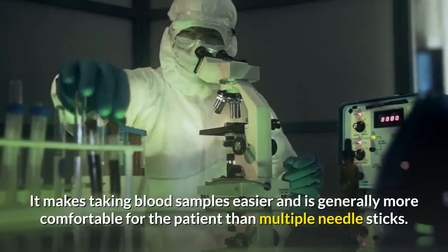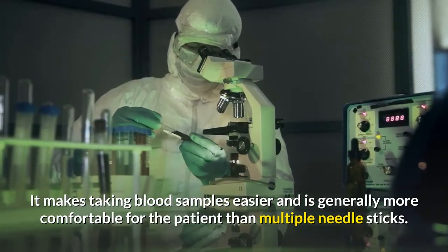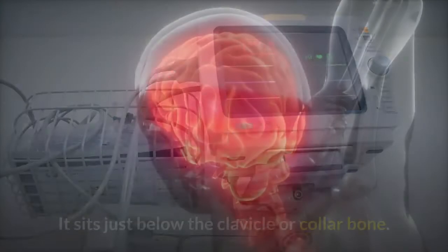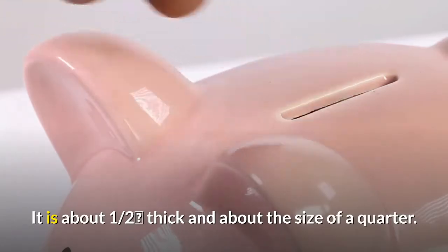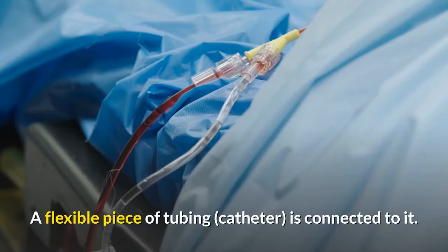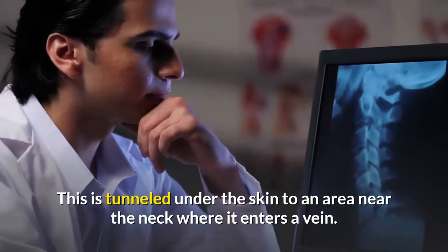It makes taking blood samples easier and is generally more comfortable for the patient than multiple needle sticks. A port is a small medical device that is installed beneath the skin, usually in the upper chest. It sits just below the clavicle or collarbone. It is about one-half inch thick and about the size of a quarter. You can feel its raised center under your skin. A flexible piece of tubing, called a catheter, is connected to it. This is tunneled under the skin to an area near the neck where it enters a vein.